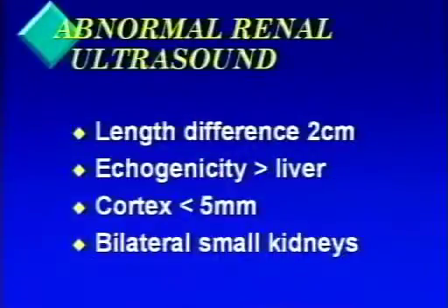We want to take a look at both the right and left kidneys and compare them to make sure that they have similar size, shape, and echogenicity. And we also want to look to see if there's any tumor present or if the patient has hydronephrosis or any other abnormalities.